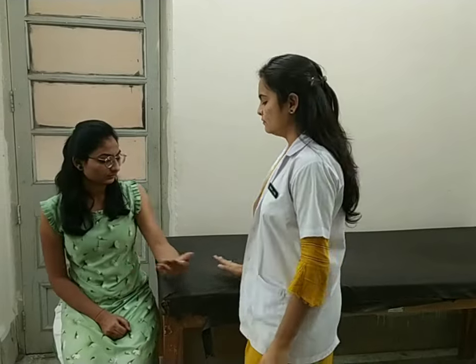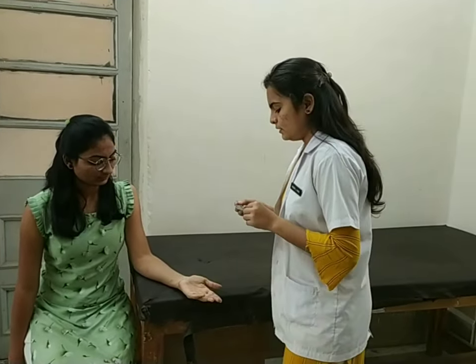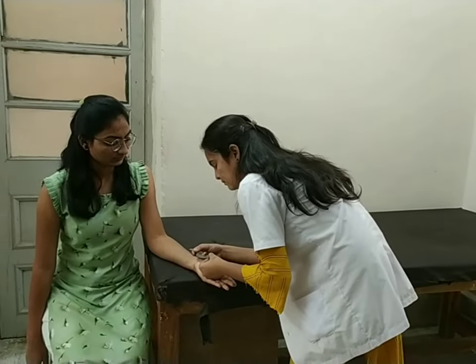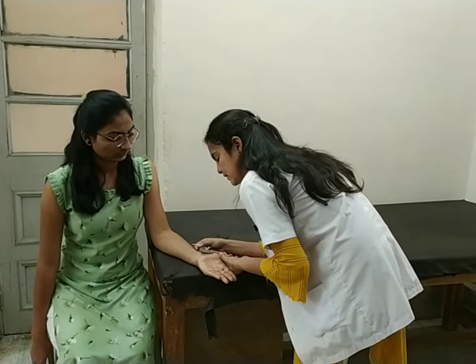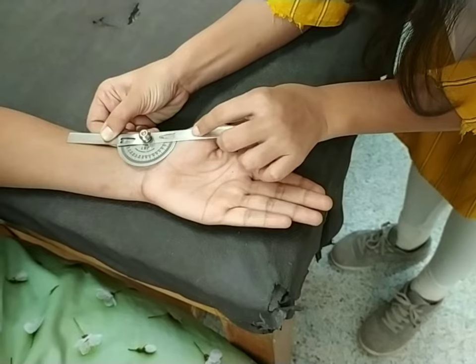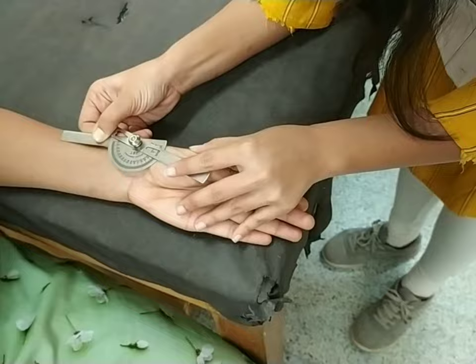For carpometacarpal joint flexion, position of the patient sitting with forearm and palm resting in supination. Fulcrum over the ventral aspect of the carpometacarpal joint. Stable arm over the palmar aspect of the first metacarpal and moveable arm over the palmar aspect of the radius. Ask the patient to move your thumb towards the little finger. Normal range of carpometacarpal flexion is 0 to 50 degrees.